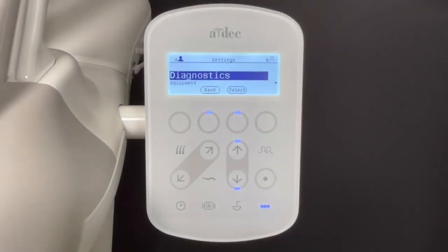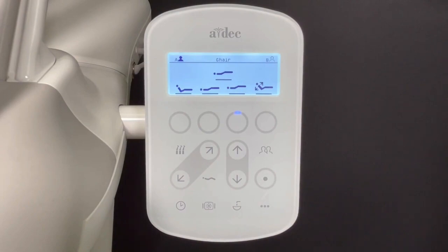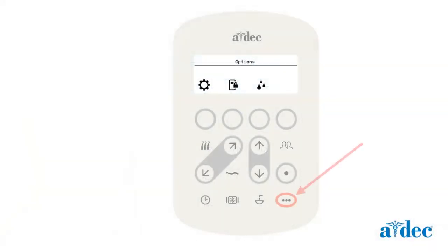When in a menu, these equipment icons can be used to exit the menu and access the desired equipment function, much like a home button. The Options menu button is used to access the Settings menu, Screen Lock for cleaning, and Handpiece Flush for systems equipped with a CP5i.